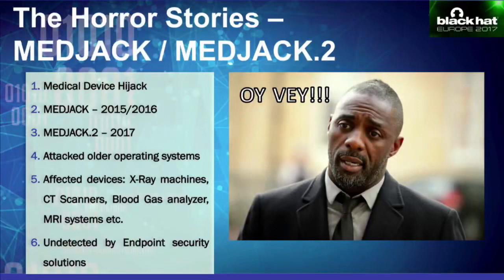One important thing about MedJack was that it went undetected by a lot of endpoint solutions. That happened because MedJack was only targeting older operating systems and older, outdated vulnerabilities. When that malicious packet reached a modern operating system, it was already patched against it, so it simply ignored the packet. It didn't even reach the endpoint solution. So it was stealthy, and it was able to compromise a lot of medical devices that had older operating systems. Older operating systems don't have any protection against malware or a security endpoint solution, so they didn't report the malicious activity either.